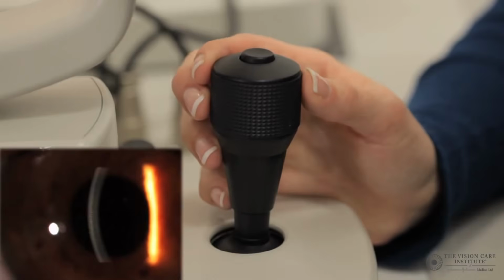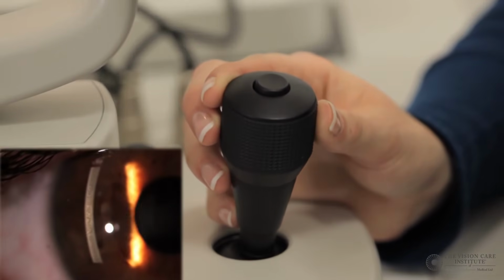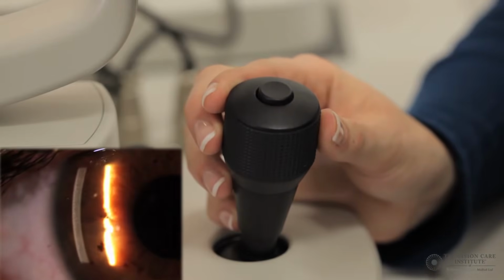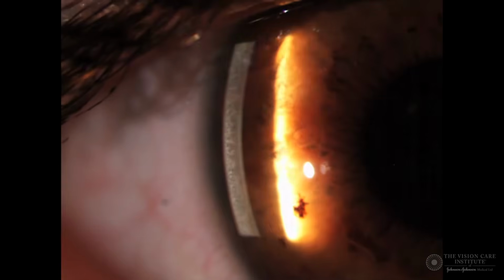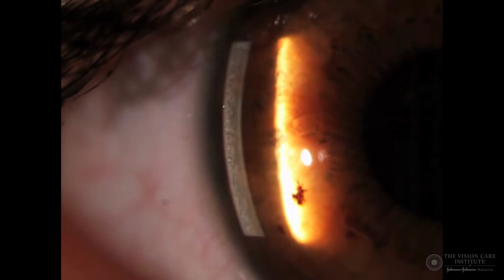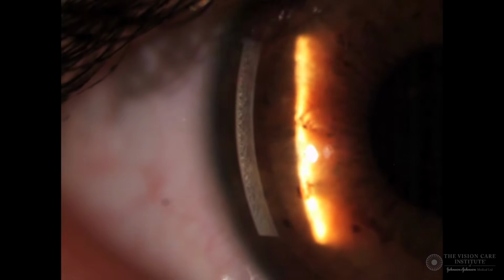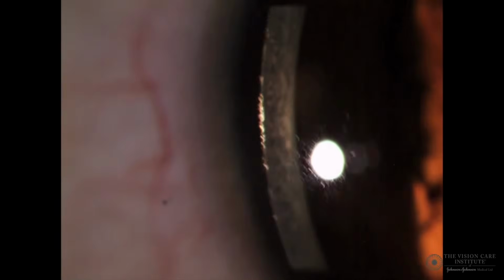And whilst keeping the section in focus, we can try to move the whole section to the temporal part of the cornea. By doing this, more of the corneal layers will become visible because the cornea is thicker in this area and more differentiated. By focusing very accurately, and by making the magnification higher still, we are able to see all the different layers of the cornea.